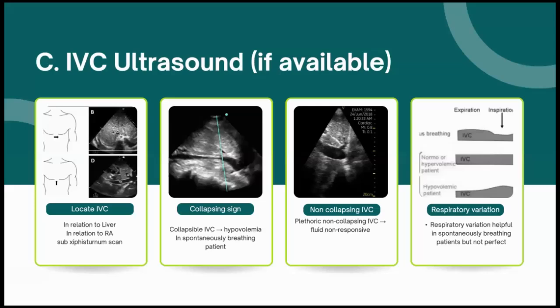Perfusion index is this much, and on the echo, you can say, I just had a look at the LV. The LV is not contracting very well. The systolic blood pressure is 90. So your next call will be something like that to us, I guess.